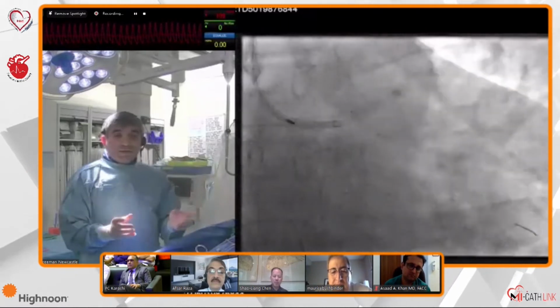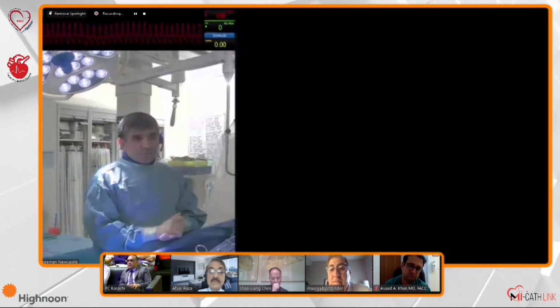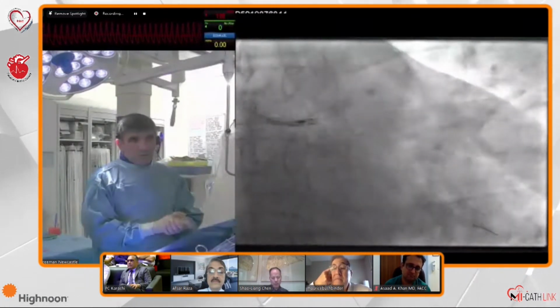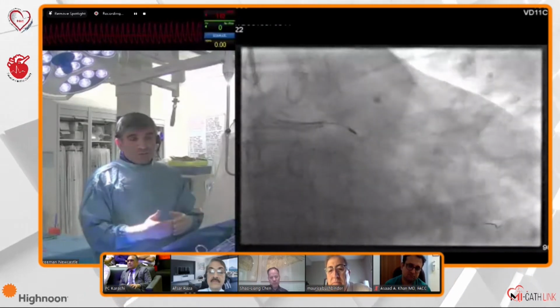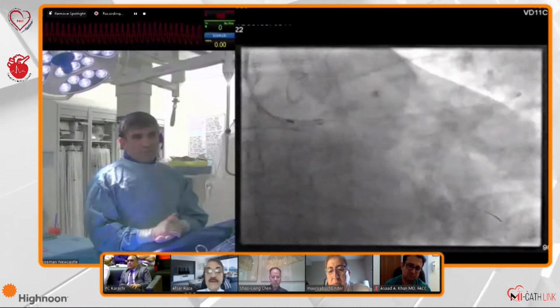I hardly ever use it otherwise; it's only for severe tortuosity in cases like this. So this was a 1.25 burr. Go forward. And the speed was 185,000, which I usually use for the 1.25 and 1.5. We did 3 or 4 runs, and there was some deceleration as you would expect. And then everything became okay. The polishing run was very smooth and nice. And there we go. Next one.